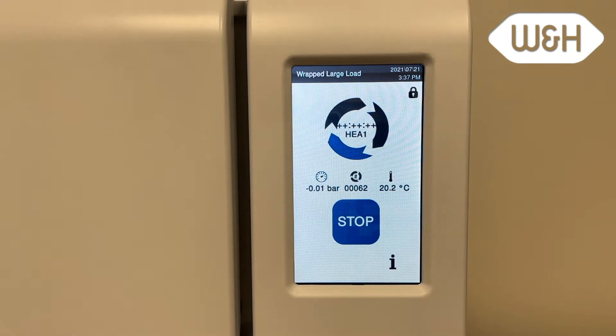The screen shows the remaining cycle time. Press stop any time to abort a cycle. Please note that when aborting a cycle, the load might not be sterile.